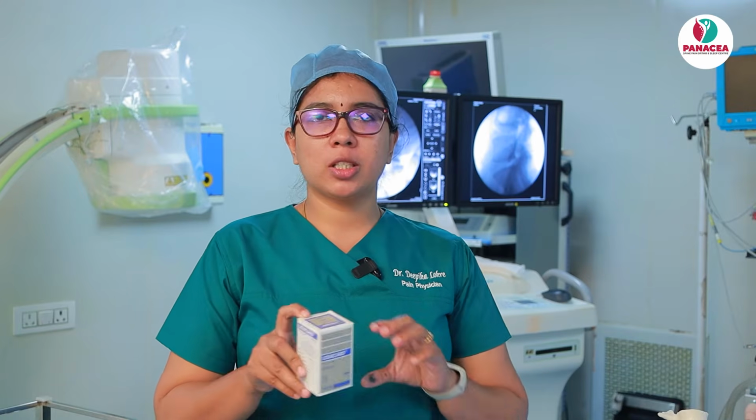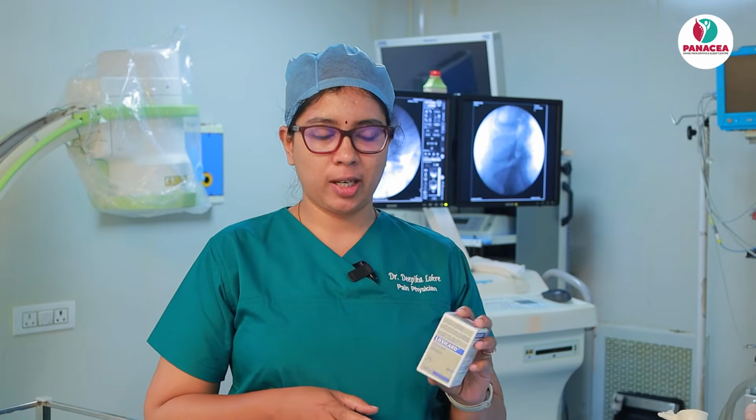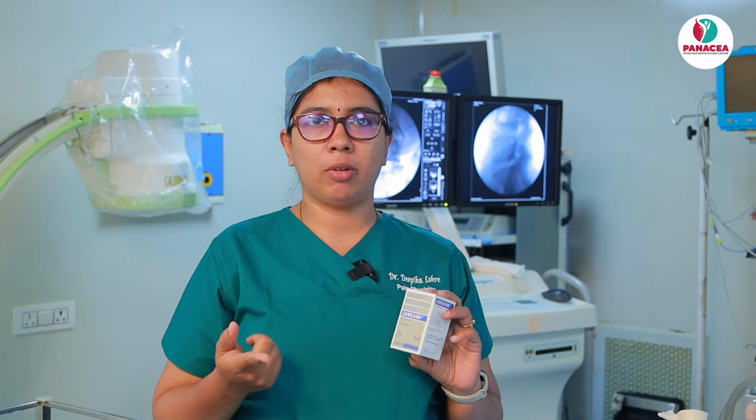So we are going to first use for our local this lignocaine. This is preservative free 2% lignocaine, which we are going to dilute to 1%. That is 1 ml of lignocaine and 1 ml of saline we will take, and we will dilute it and we will give the drug. This is for local, and we will use a 26 gauge long needle for giving the local, because the needle should be as small as possible to avoid too much pain during the local anesthetic which we are going to infiltrate. So for infiltration, we have to use a smaller needle, as small as possible. 25 to 26 gauge is usually acceptable. So we will be using this.